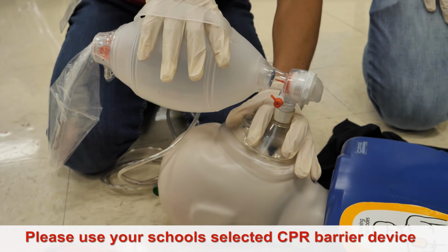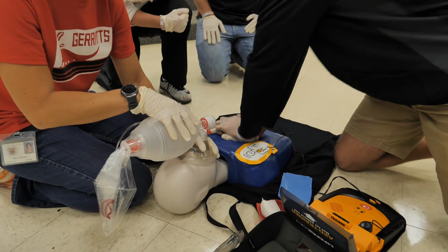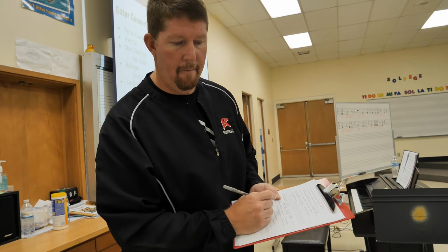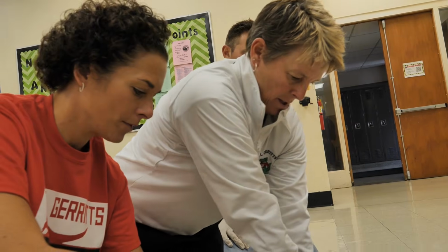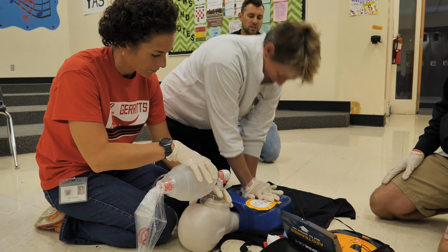2, 1, 2, 3, 4, 5, 6, 7, 8, 9, 10, 11, 12, 13, 14, 15, 16, 17, 18, 19, 20, 21, 22, 23, 24, 25, 26, 27, 28, 29, 30. 1, 2. Continue care. 2, 3, 4, 5, 6, 7.